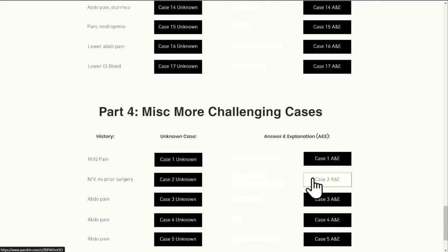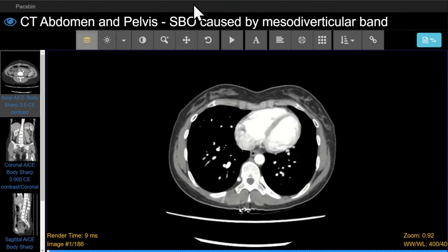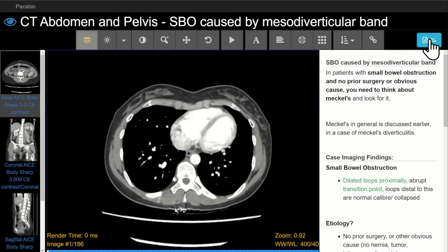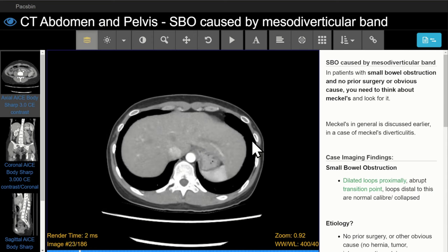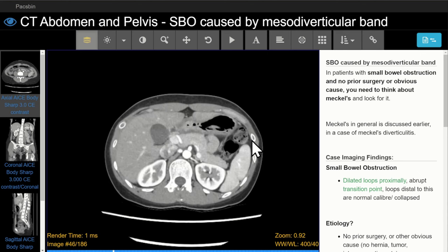Once you've had a look at the case as an unknown, you can review the answers in the course by clicking the answers and explanation link on the right. The answer is that this is a small bowel obstruction caused by a mesodiverticular band of a Meckel's diverticulum. Again, we can click the blue square in the top right corner to go through the imaging findings in detail. Let's approach this bowel obstruction the same way we taught you previously.